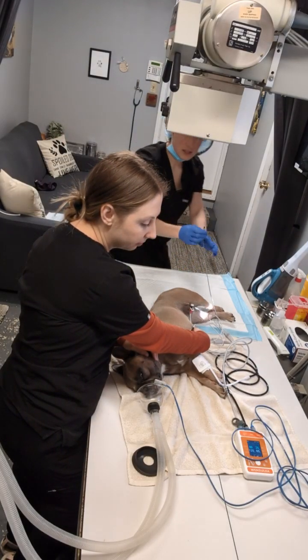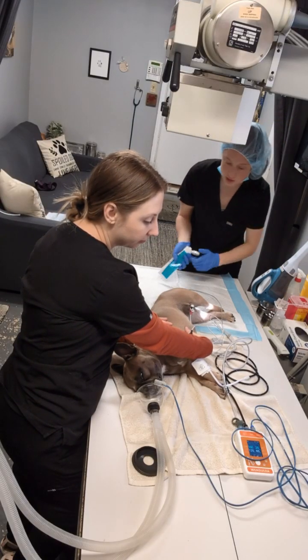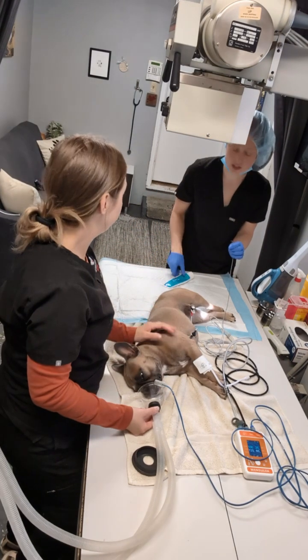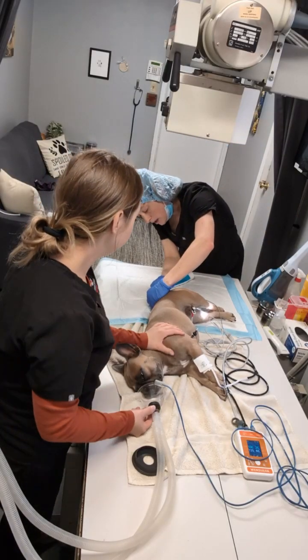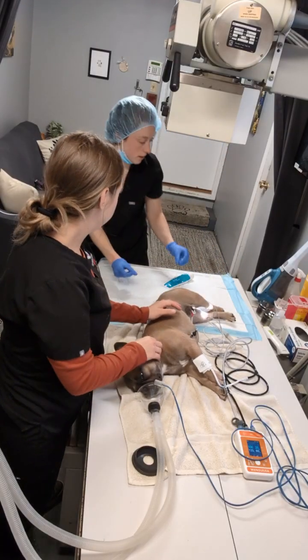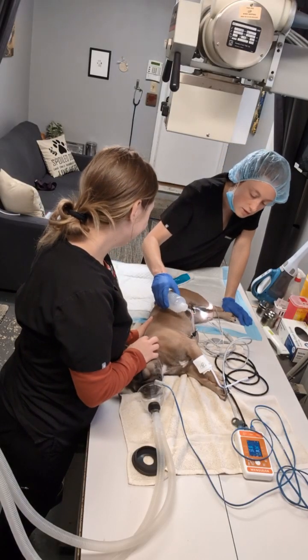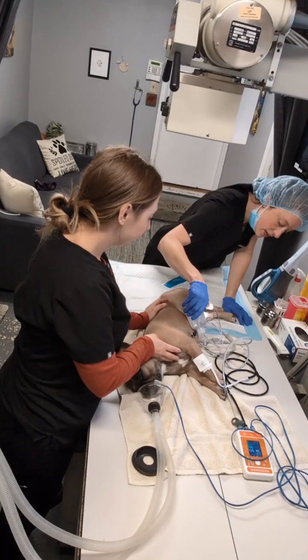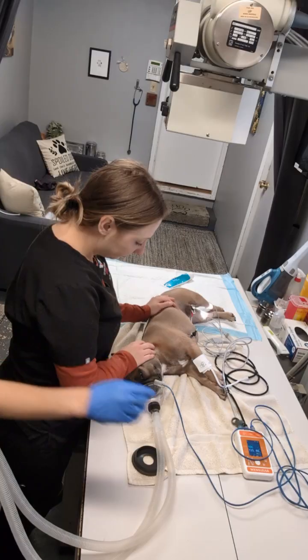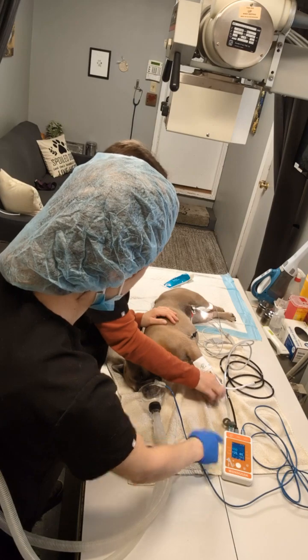And that monitor also has the temperature probe attached to it. So it just has a probe that you can insert rectally or via the esophagus. I'll put it in the rectum for now, but we might end up moving that. Just add some alcohol to help with the electrodes. And then we just want to make sure everything is reading well on the screen.